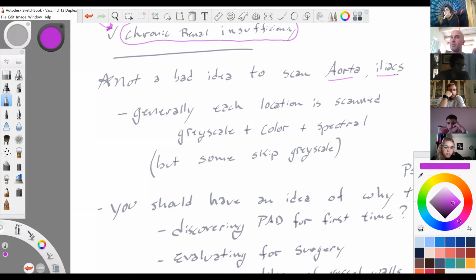And this is minimums. This is not, you found disease, then you have more. Popliteal, minimal one, but I do at least 2 or 3 locations personally. The popliteal is a bit of a trouble area, so I like to get more than one image there.